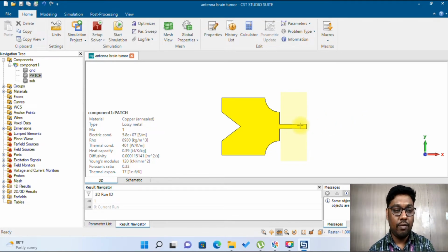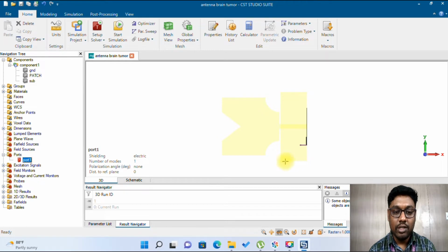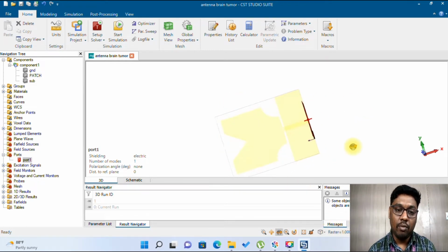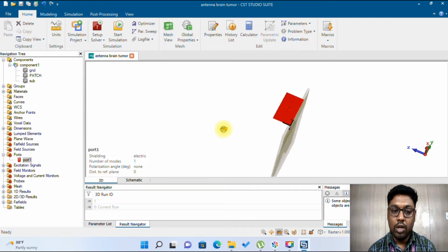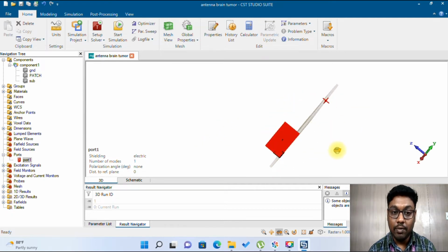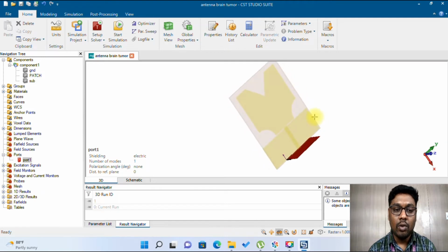Once I completed the ground, patch and substrate design, the next part is to create the port. You can see that the port is created over here, which matches 50 ohm impedance. Properly attaching a port is a significant thing, as you need to avoid all the losses, so we create the port by matching 50 ohm impedance. That's the design.